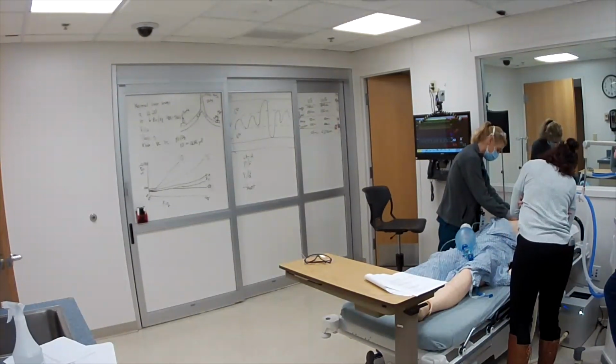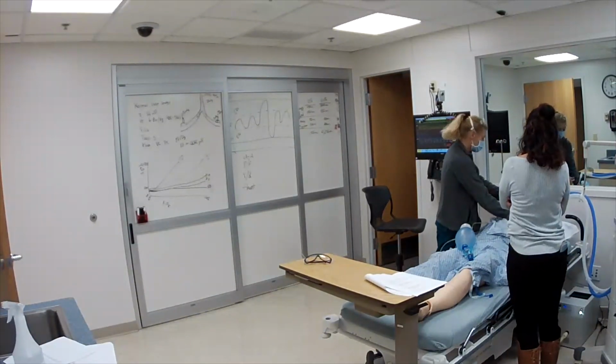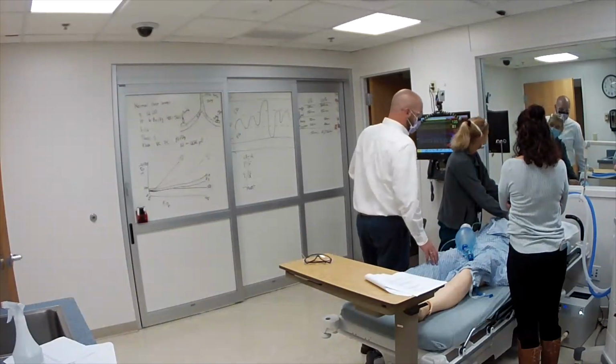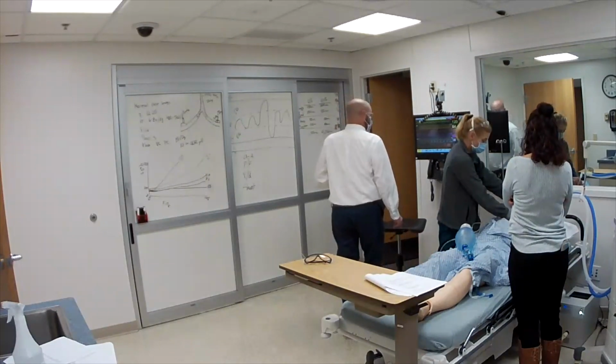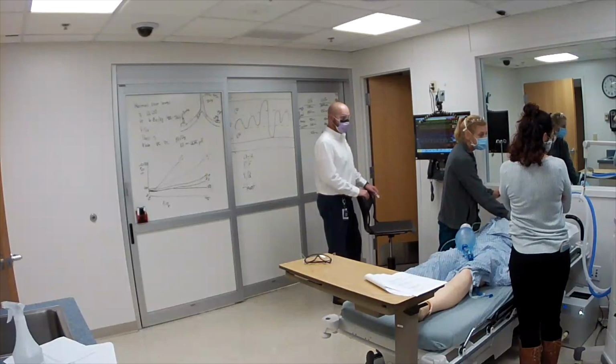Okay, so you got the needle in. Now we look at our vital signs. Look at that. How about that? Way to go, Stanley. How's your vent look, Shan? Much better, yeah. Got rid of that high pressure. We fixed our shock state.